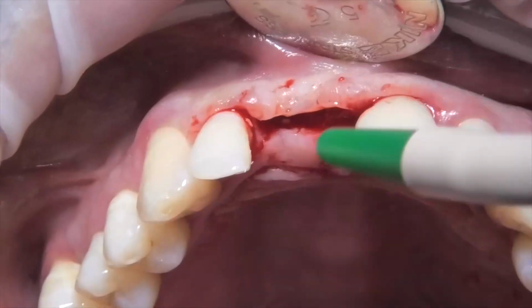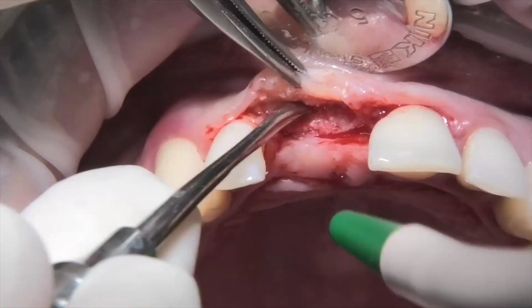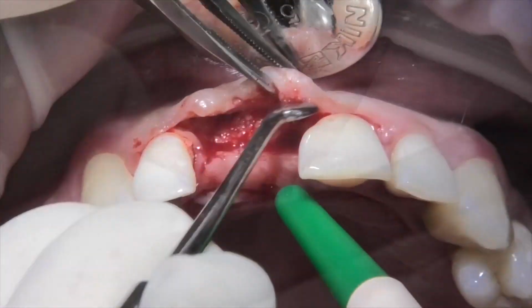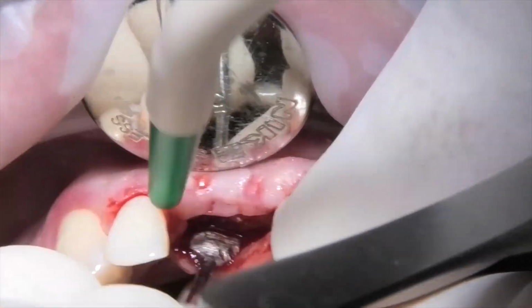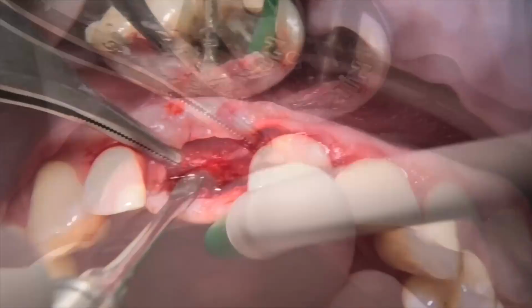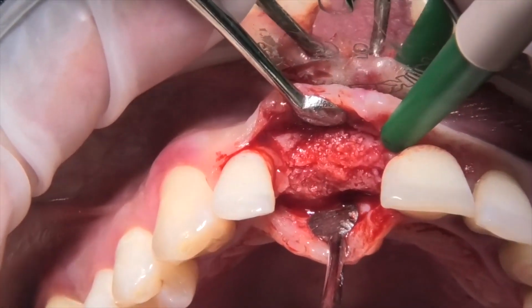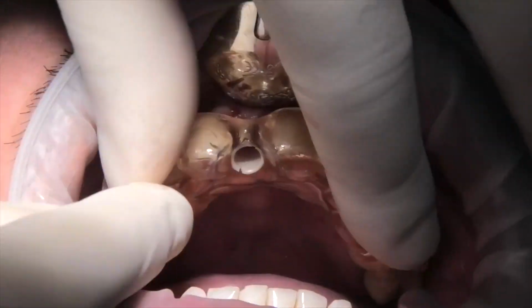vestibularly and also in the palatal area. So the bone regeneration is good, a situation completely different from the initial situation before the first surgery. We can see the new bone crest, with the bone graft still maturing.